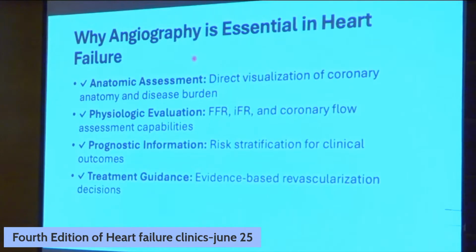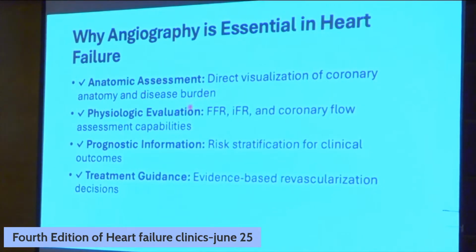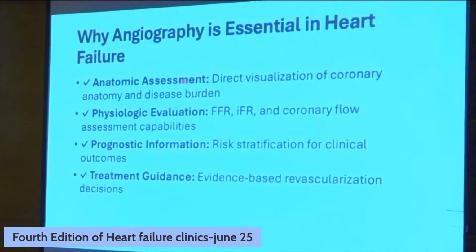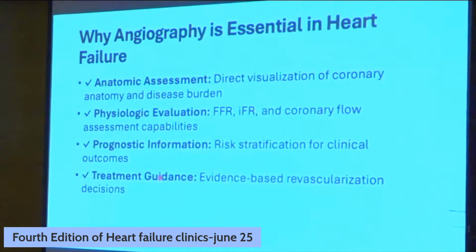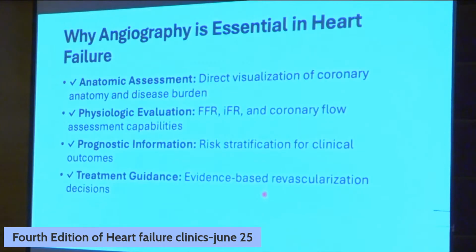So in a patient, why is coronary angiography very important? We can assess the anatomy, and if we use some advanced modalities, we can have the physiology, and with the physiology, we can risk stratify the patient. Based upon the anatomy, physiology, and risk stratification, we can guide the treatment. What is the best way to revascularize the patient? So by coronary angiography, we can assess the anatomy, physiology, risk stratify the patient, as well as plan and perform the further revascularization procedures for these patients.